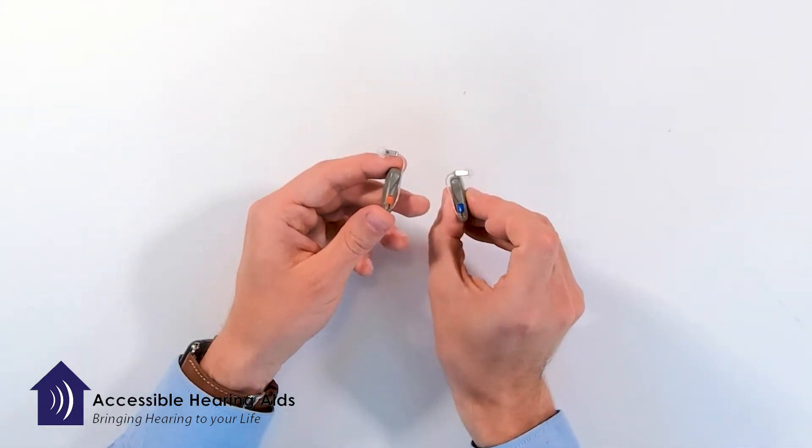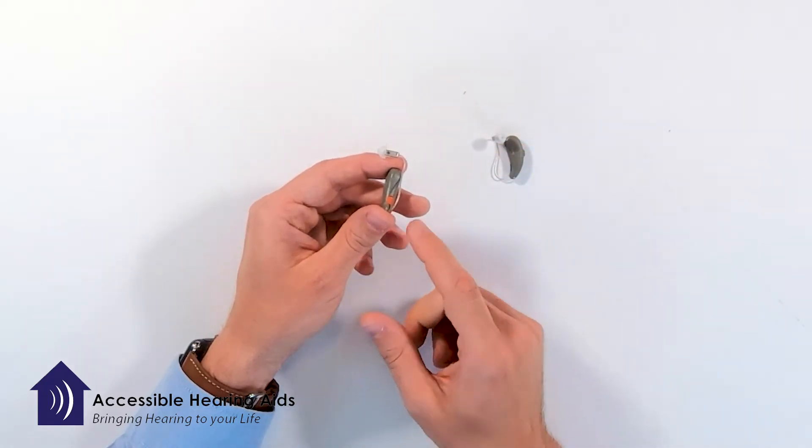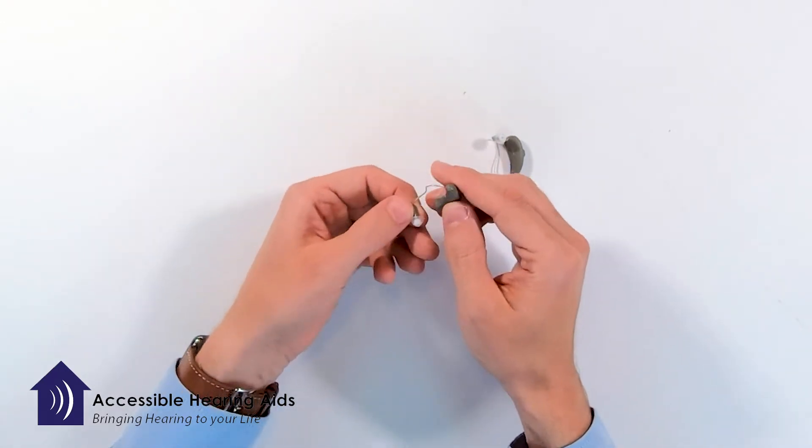We color code everything when it comes to hearing devices — red always for the right. So when you're putting it on, I like to recommend holding it and turning it to where you can see it.